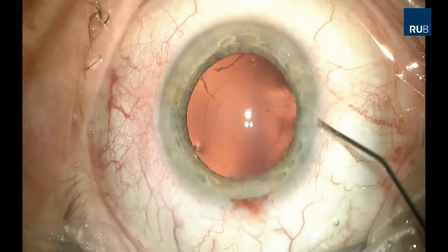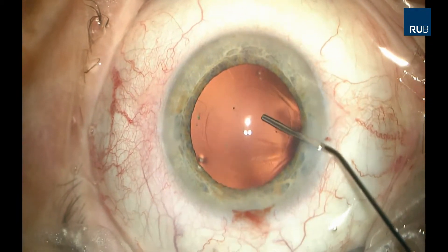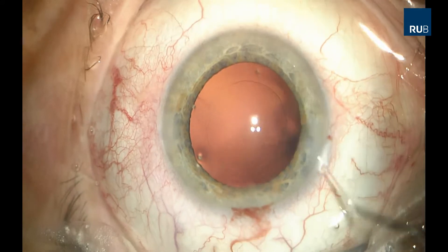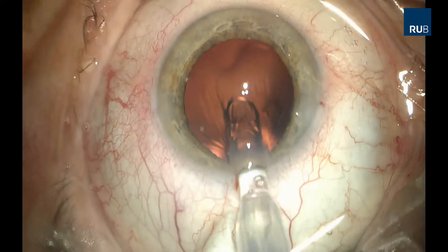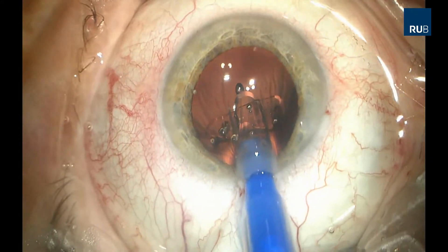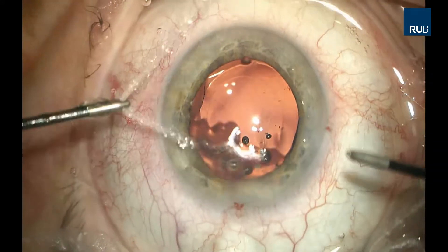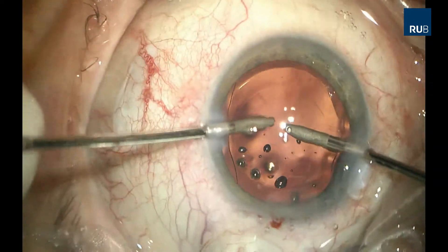Again, OVD is injected and a plate haptic intraocular lens is implanted. The residual OVD is removed and the incisions are hydrated.